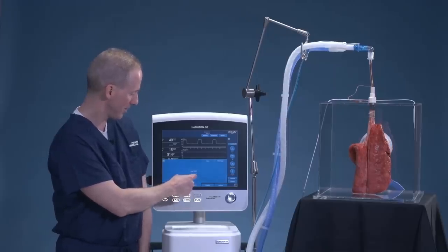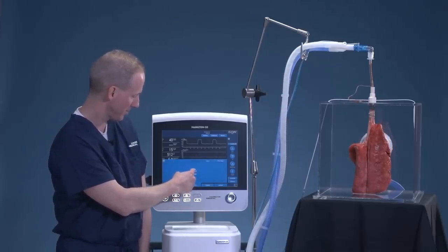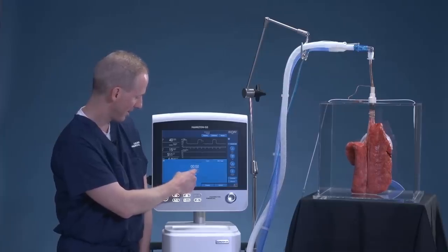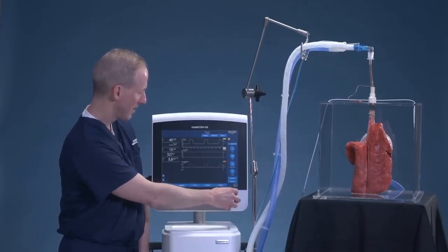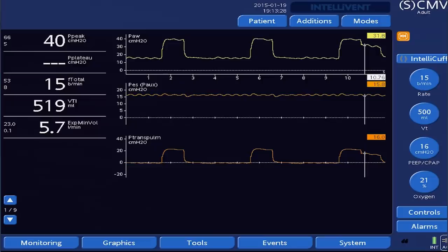If we perform a short inspiratory hold — let's do an inspiratory hold now — and freeze this screen during the inspiratory plateau, the airway pressure reads 32 centimeters of water pressure. The pressure outside the lungs is 16, ending with a transpulmonary plateau pressure of 16 centimeters of water pressure.